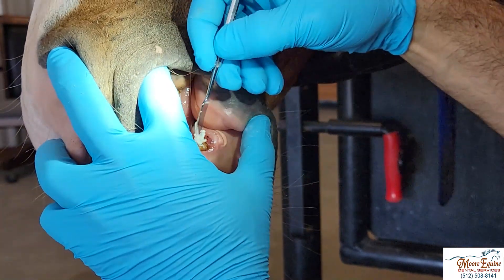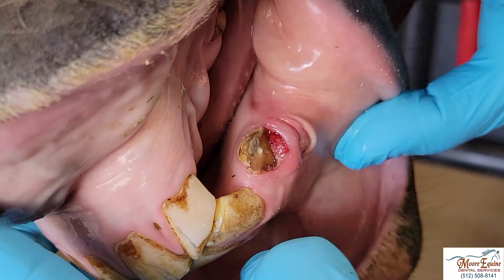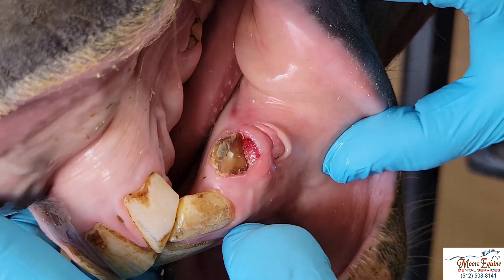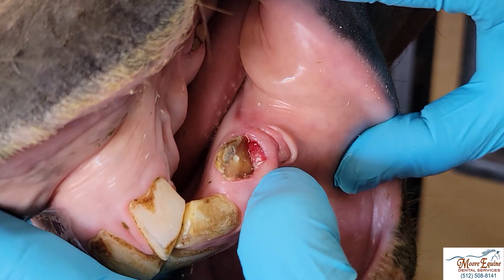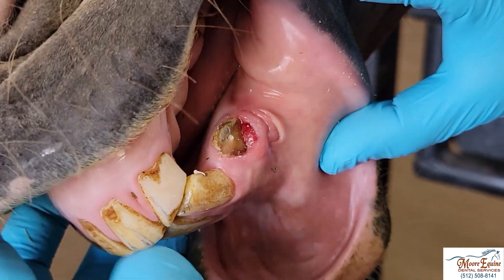A material that's very effective here is IRM — Intermediate Restorative Material. You can just put that on there, or use a cement, but this works pretty well. The pulp canal is now sealed off, and because it's a canine it's not in wear and won't be ground down, so it should maintain itself without any problem. We'll resect a little bit of this gingiva and buff the canine so it's not quite so sharp.